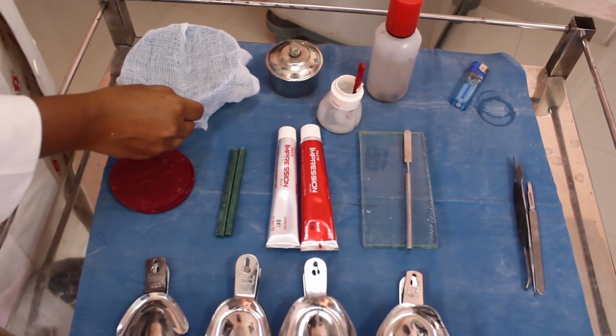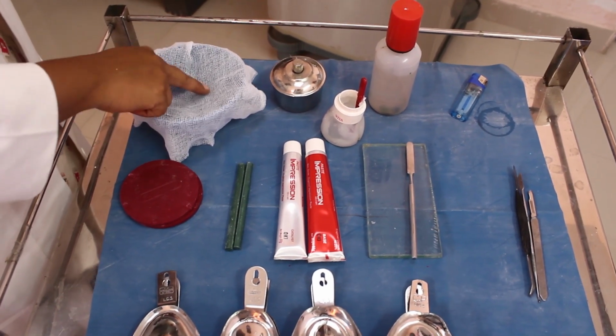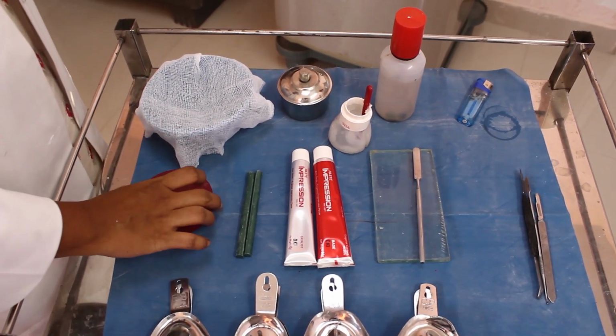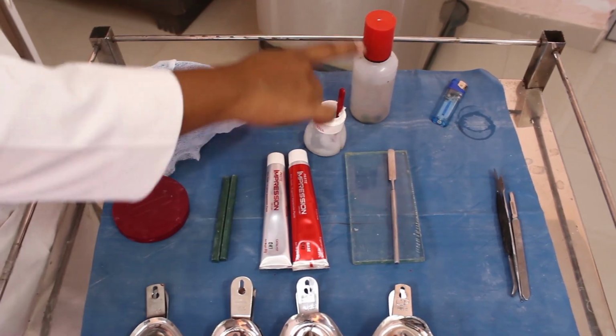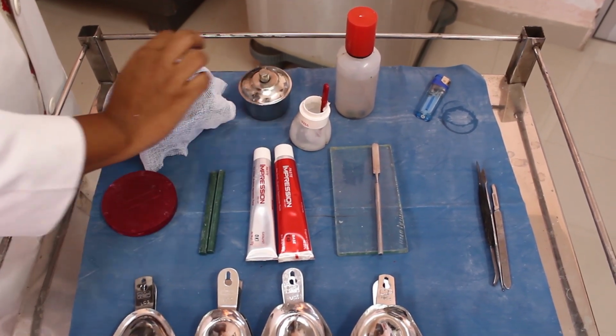This is the rubber bowl which we use to have the hot water. Since it's a thermoplastic material, we are going to soften it using the hot water. These are all the other armamentariums which are used. You will be seeing it in the procedure. Today we are going to see about the steps for primary impression for complete denture.